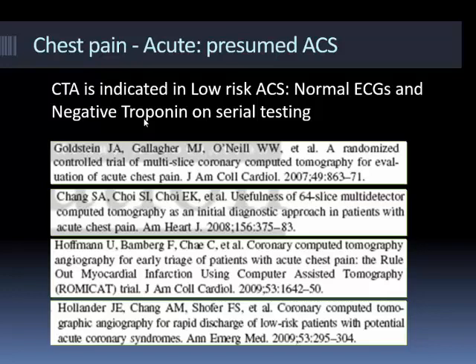So there's been lots and lots of papers fairly recently trying to look at the role of CT angiography in the emergency department setting. So these are patients who present who you don't think have coronary artery disease. Can you do a CT angiogram in these patients, for example, and discharge a group and risk stratify a group that then needs further investigation?